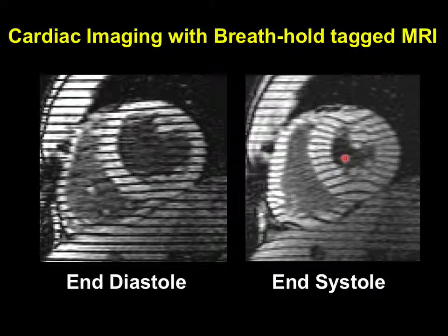So this gives you a set of fiducial markers now, which is like an image processing scientist's playground, right? You've got all of these things you can now detect and measure the underlying displacement field based on what you find in these pictures, right? So in some sense, this picture is probably 50 milliseconds after the application of the tags, and you can see there is already some displacement in the heart. So we're a little bit late into the game. The heart's already started to contract here.